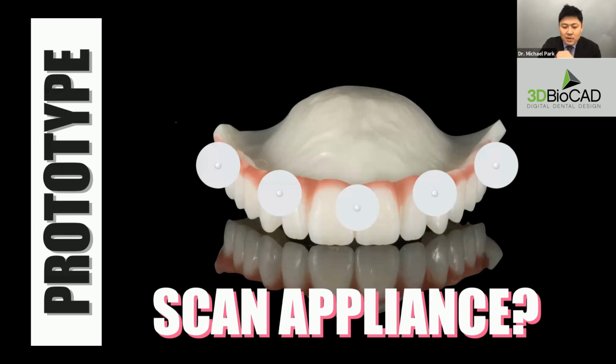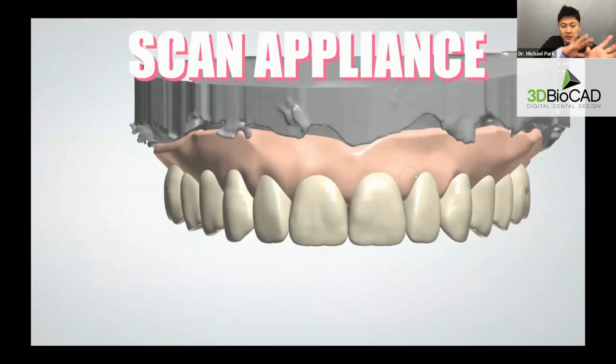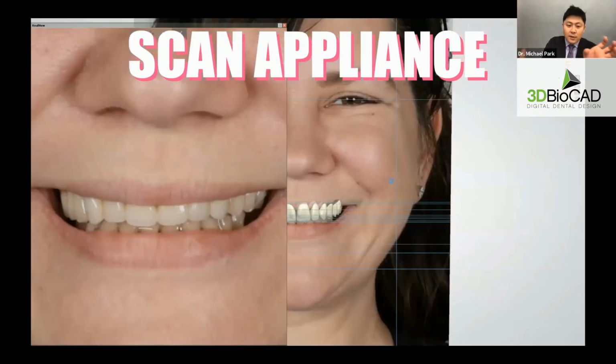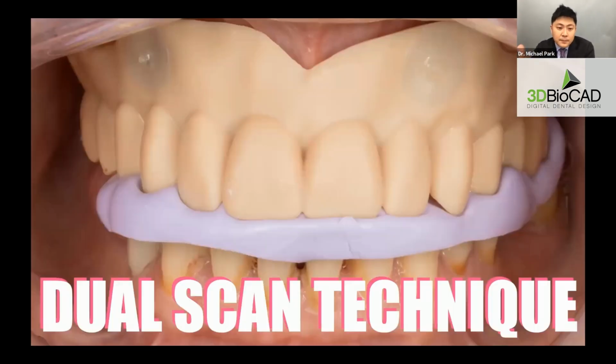So what we do is we go back to the wax up, where we created a wax up and the record base, and we just extend the record base on the buccal so that it has a flange. And then we can export this as an STL file, and then we can either mill it or 3D print the scan appliance. So that's the 3D printed scan appliance inside the mouth with fiducial markers and the bite registration in between to seat the scan appliance in the correct position.